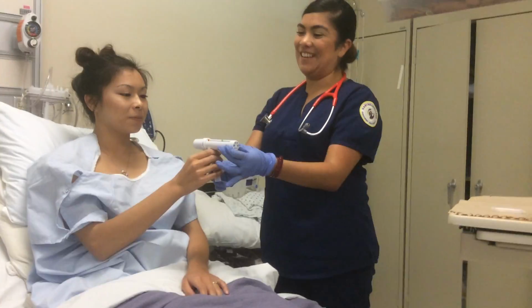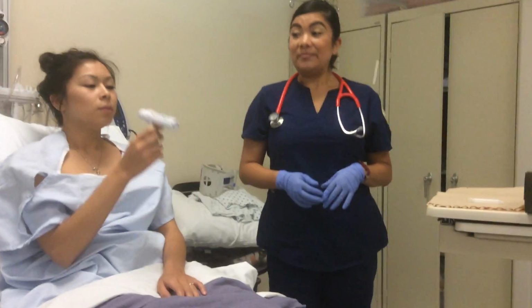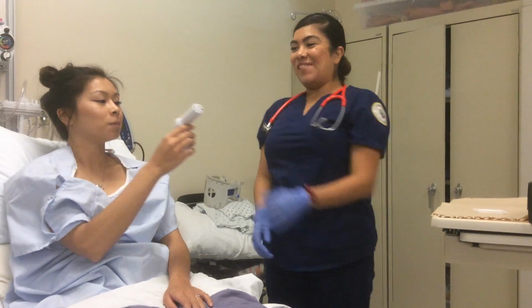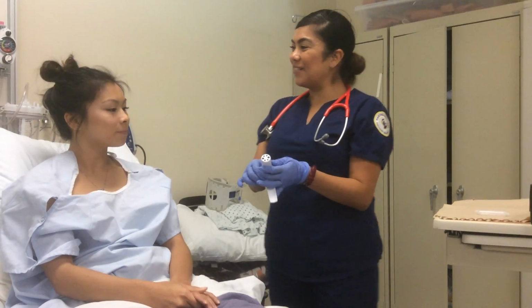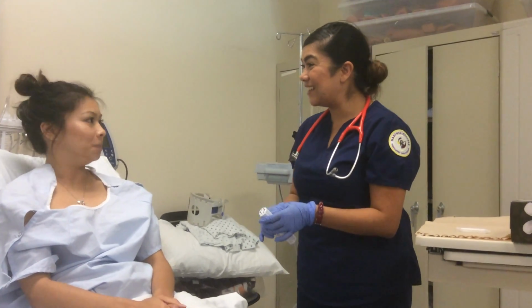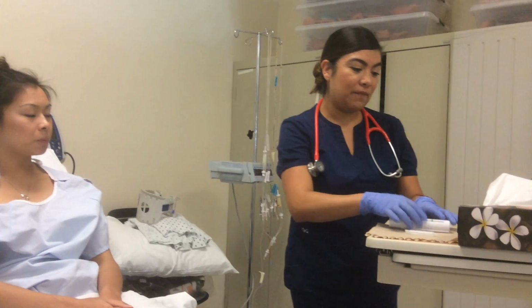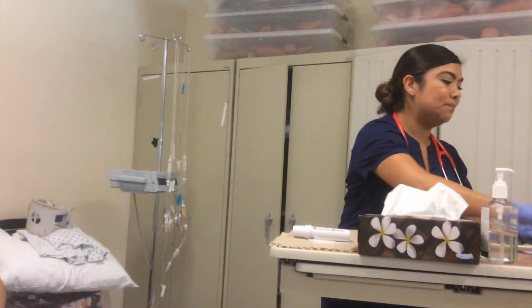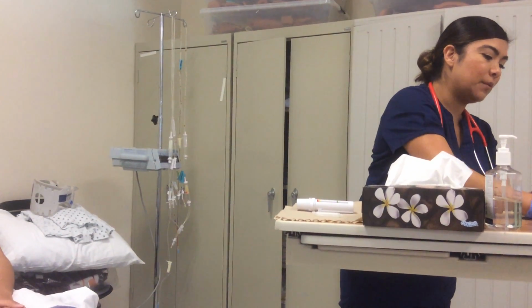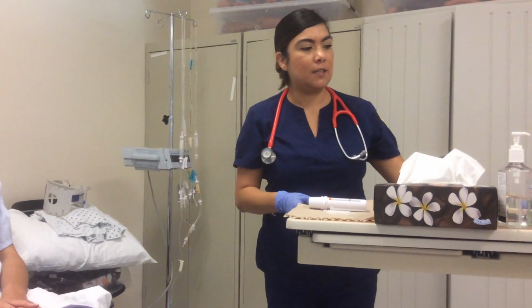Okay. All right. You feeling okay? Very good. Bingo. There we go. I knew you could. You reached your goal. Very good. Are you feeling dizzy? Okay. Well, you did an excellent job on this. Perfect. So we reached 418. Okay. Perfect.